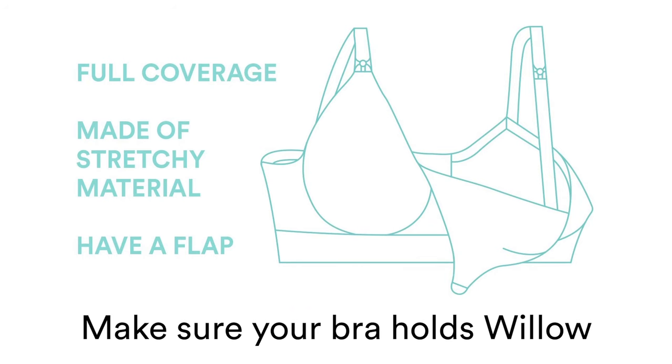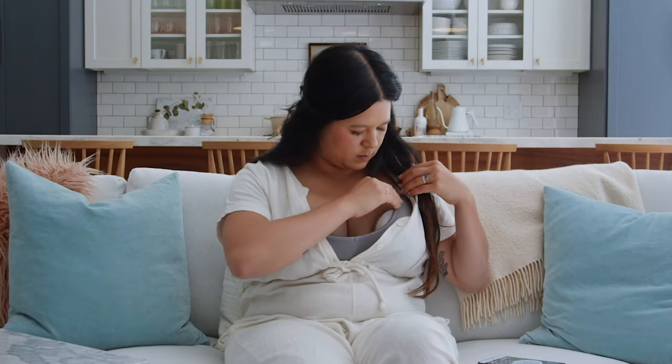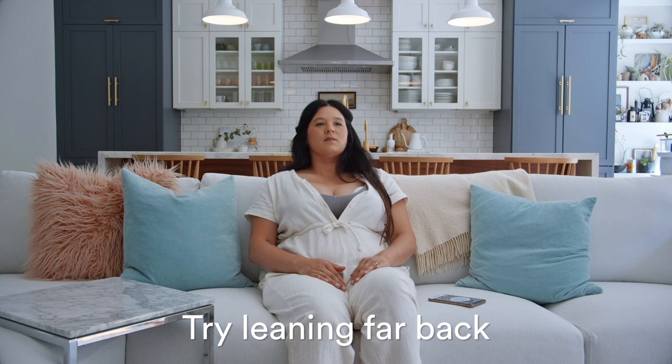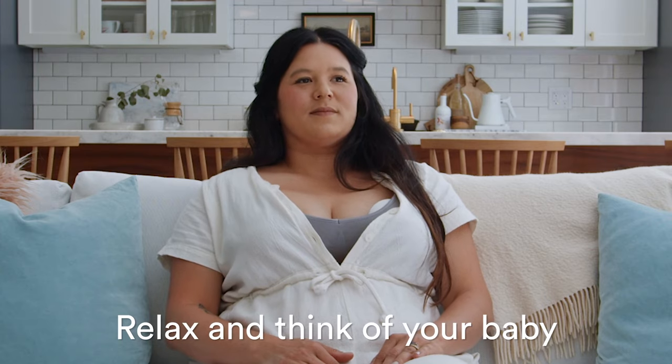Wear the right bra and make sure Willow is held snugly to the breast with no gaps. The blue thumb pad or cap should be pressed against your breast. Try leaning back — we mean really lean back — just until you get into expression. And remember to relax and think of your baby. This can help with letdown.